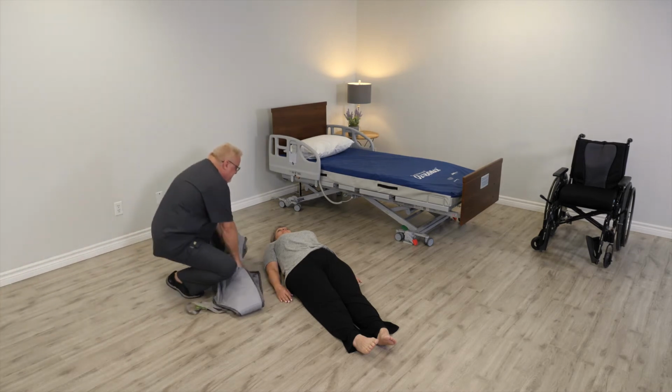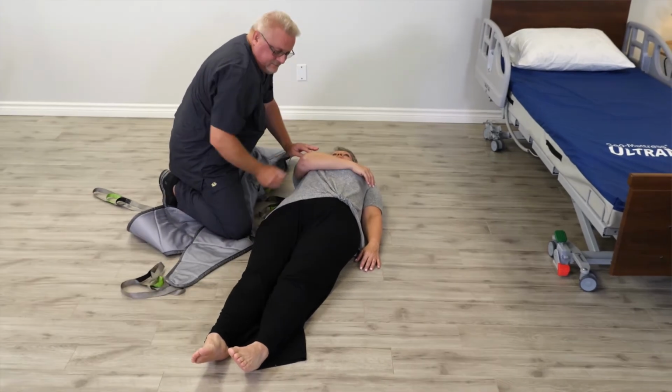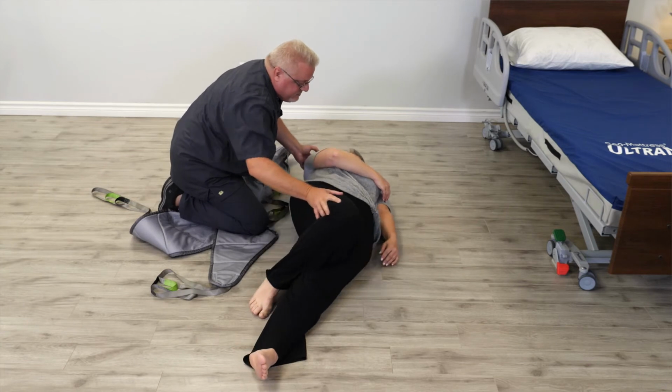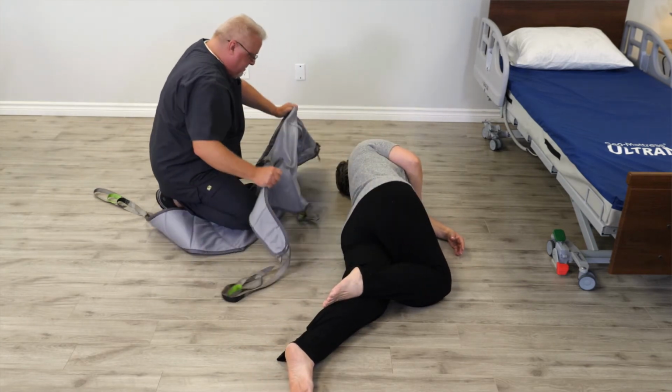To do a log roll, first you decide which direction to roll the patient. You lay the arm closest to the caregiver doing the pushing of the roll onto the patient's chest, and bend the nearest knee. You then push the patient over onto their side.